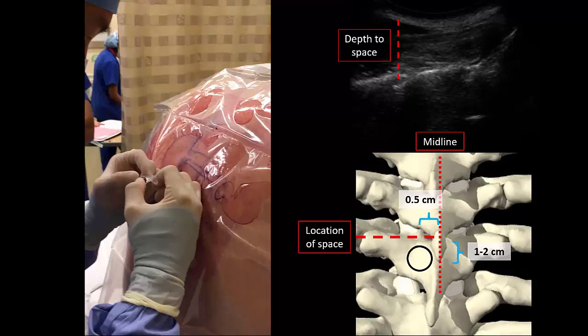The needle is inserted more or less perpendicular to the skin to contact the lamina as a starting point. The needle is then gradually walked cranially up the lamina until it slips off the edge into the interlaminar space. Note as always that the lateral to medial angle is very small and does not change as the needle is walked up cranially in this paraspinous approach.